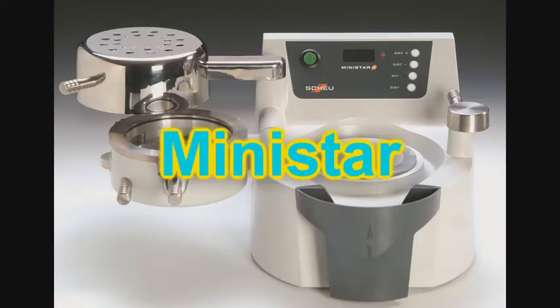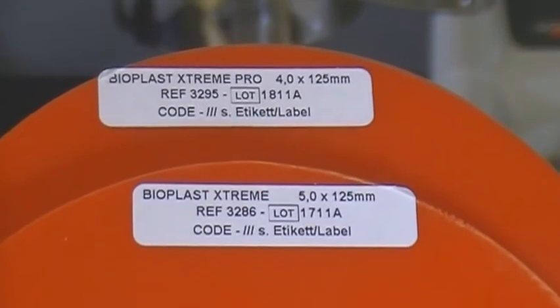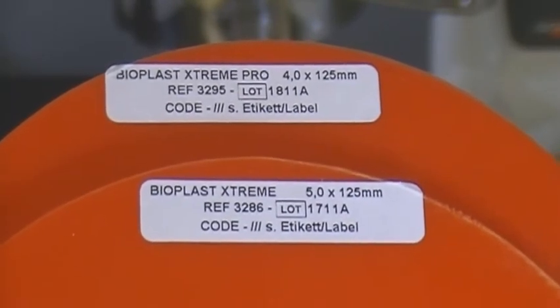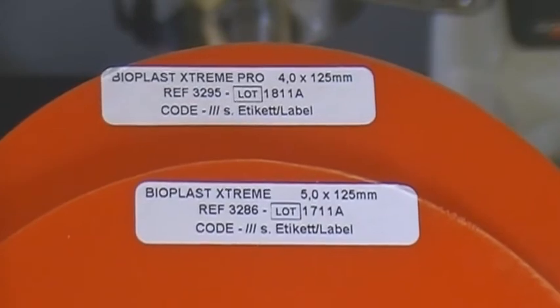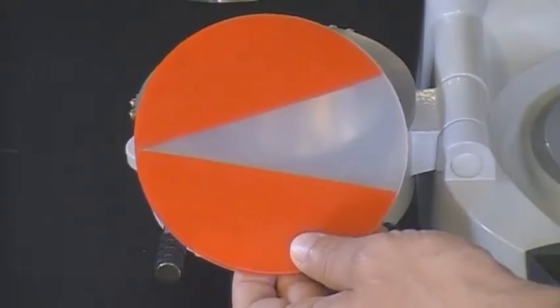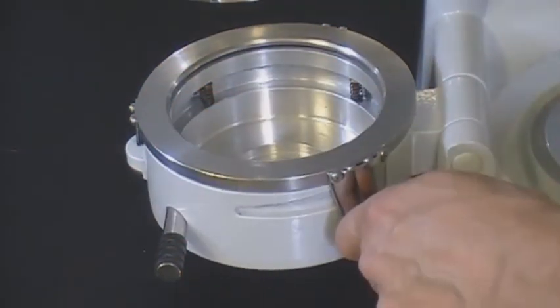Bioplast Xtreme Pro material will be processed using the MiniStar machine. A Bioplast Xtreme material is selected. The heating time for the 4mm Xtreme Pro is 100 seconds or BioStar code 247. Heating time for the 5mm Xtreme is 140 seconds or BioStar code 277. The Bioplast Xtreme plate is clamped to the pressure chamber — align the point of the clear V-shape to the left of the chamber.